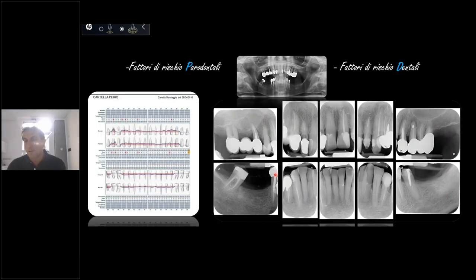This is the X-ray exam, and you can see on the screen some problems, for example, some teeth with problems. Now, if you do your exam at this moment, the measure of the machine of the Teethan is not really true, because the patient has pain. So when you do the exam, if she feels pain inside the mouth, she can't eat very well. She can't bite my cotton roll very well.